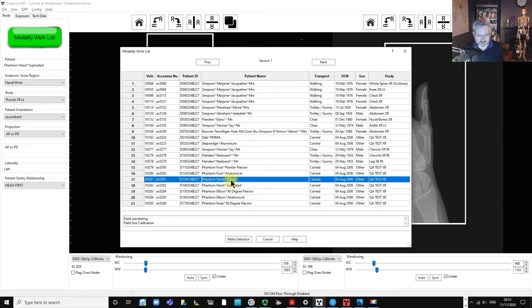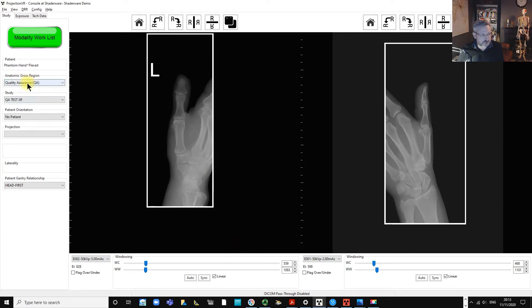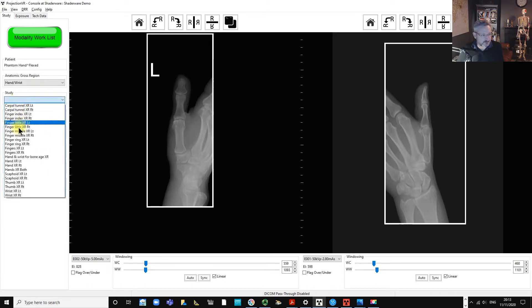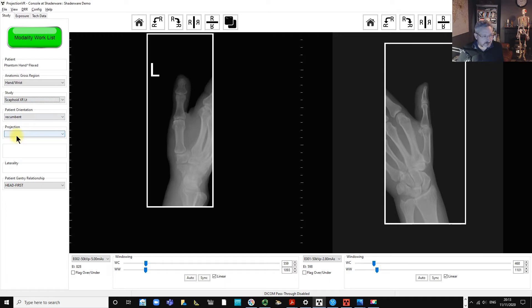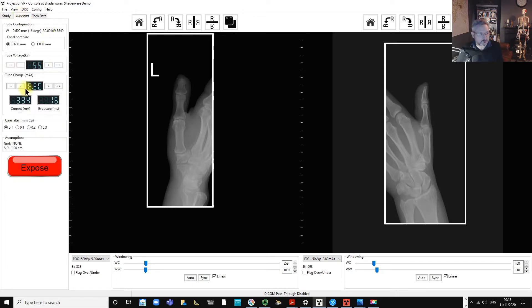The study we're going to pick uses the phantom hand flexed. We'll make the selection and choose upper extremity — wrist and hand — then pick scaphoid left. The patient's body part is recumbent and we're going to do PA. We'll set the exposure down to about two and pick our patient.